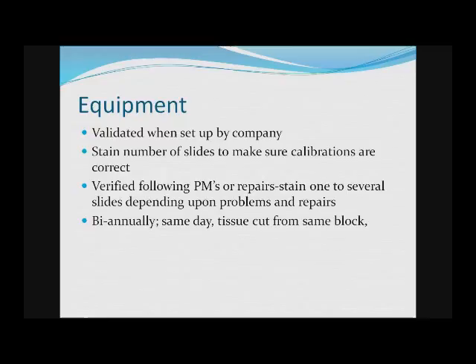The equipment. When your new equipment comes in, it needs to be set up, preferably by the company, to make sure everything is calibrated properly. There's been no screws loose or anything that could have happened in shipment, and you want to stain a number of slides to make sure all the calibrations are correct. Each of the slots are staining properly, and you want to verify following any PMs or repairs to make sure that nothing has gotten out of kilter.